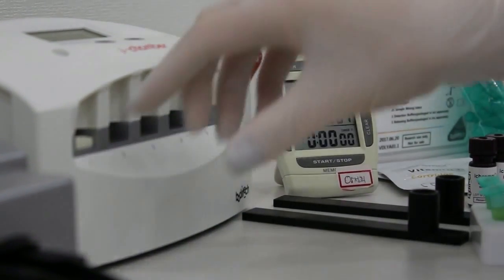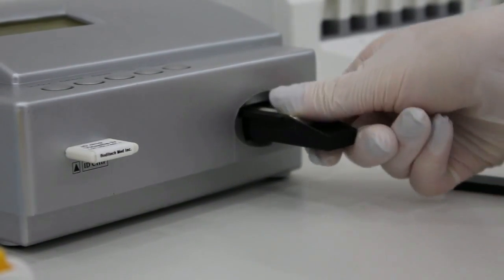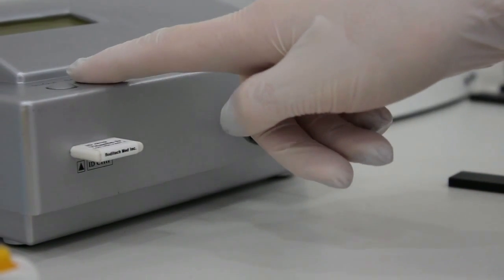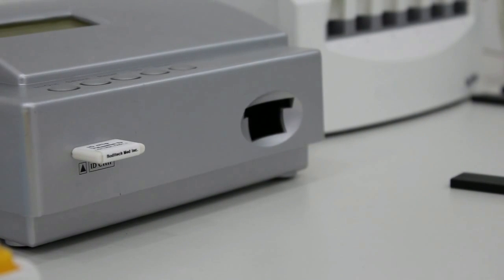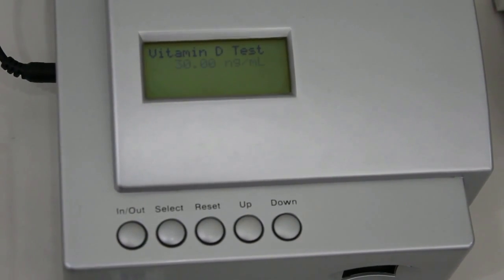After 8 minutes, immediately insert the sample loaded test cartridge into the test cartridge holder. Press select button on the iCHROMA reader to start the scanning process. The vitamin D test result will be displayed on screen.